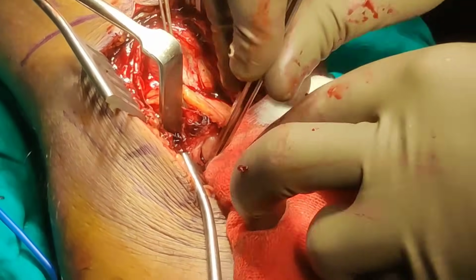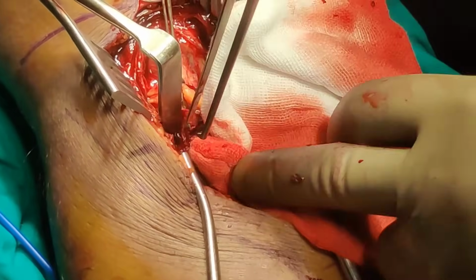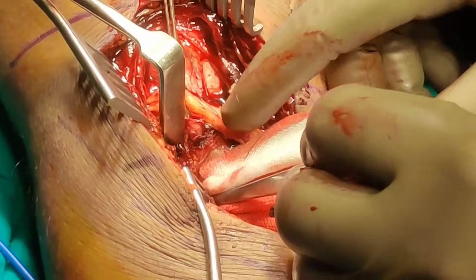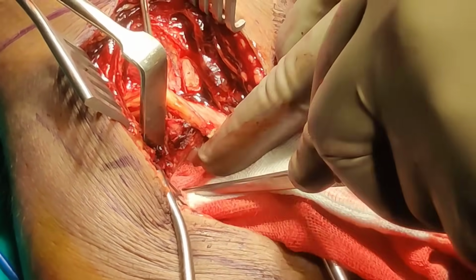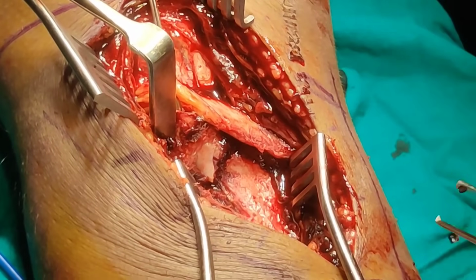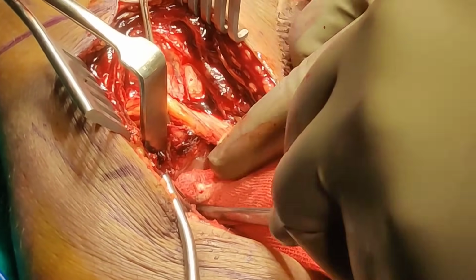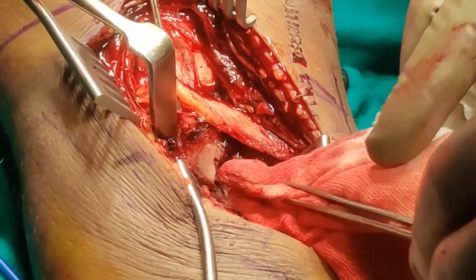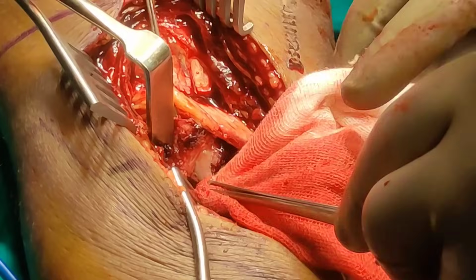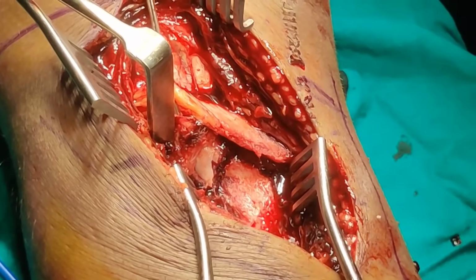So if you can see here, this is not that displaced. But the most important part when you are doing a tibial plateau is to reconstruct the height of the tibial plateau, let it be medial or lateral, needs to be restored. We focus too much on articular surface, but it's the height, and especially if you're dealing with a bicondylar fracture, reconstruct the height, fix the medial condyle first, and then move on to the lateral condyle. So let me just reduce it, and then we will show you how we fix it.